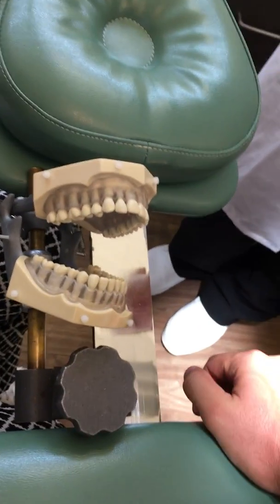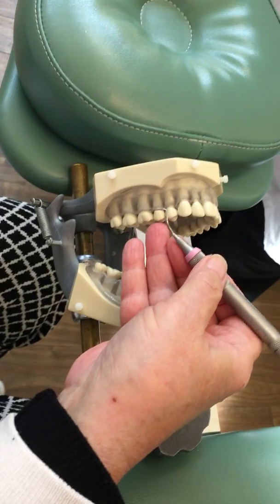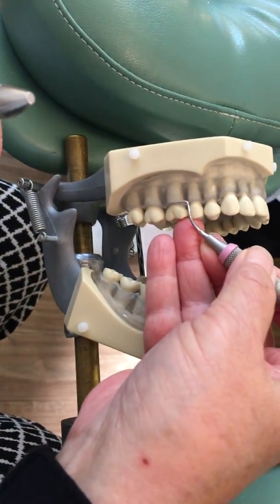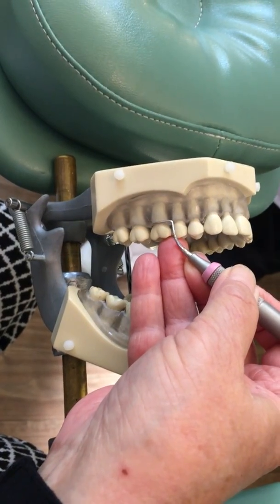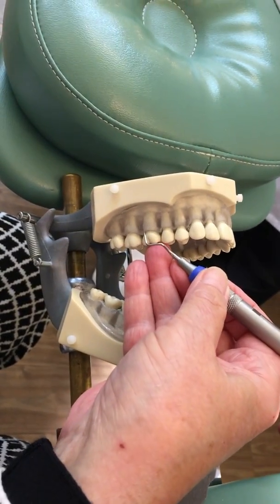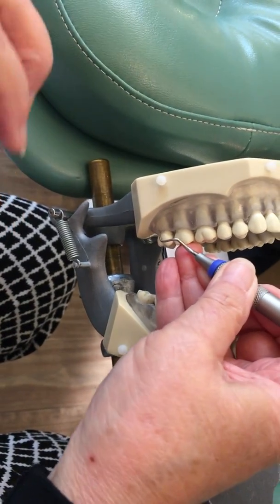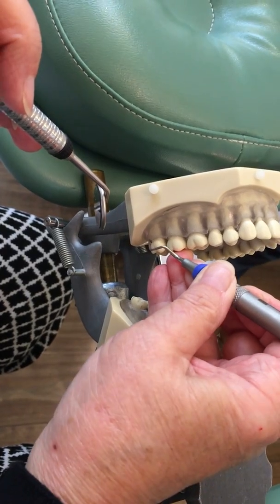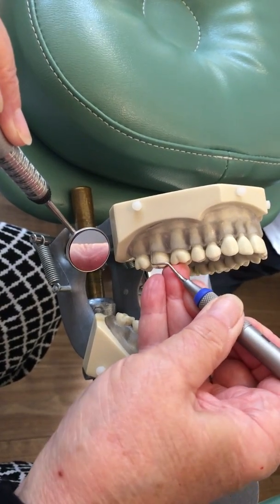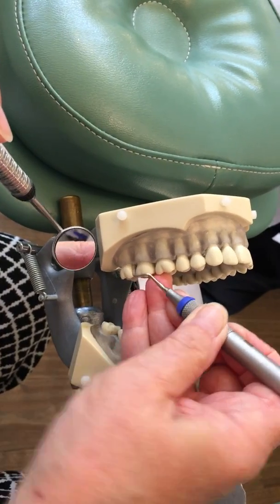Now we're going to go to our 17-18, which is our other distal instrument. Again, palm up, stretch our fulcrum up, place it on the distal, looking for the lower third of the shank — we want it parallel to the long axis of the tooth. I'm going to go in closed and then open. My mirror is retracting my cheek, and I can turn around and look at the distals if I need to — close, open, open.